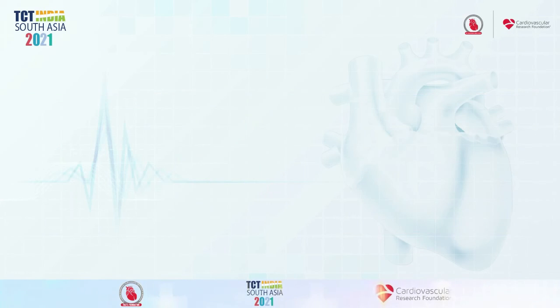Dr. Miraslo, what is the role of IVUS-guided PCI in the setting of CKD to reduce the CIN? This was the question too. Yeah, that's a point of discussion, I thought, because IVUS-guided imaging would reduce the contrast load, and IVUS-guided stent implantation and stent optimization probably would be good enough in simpler lesions, at least, even the complex lesions, both. Even in simple lesions, I fully agree with you.